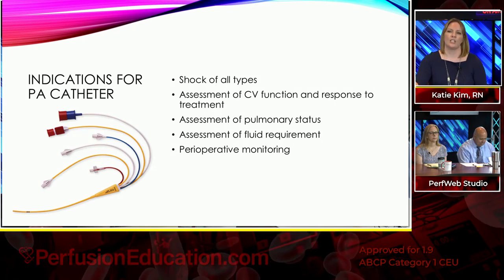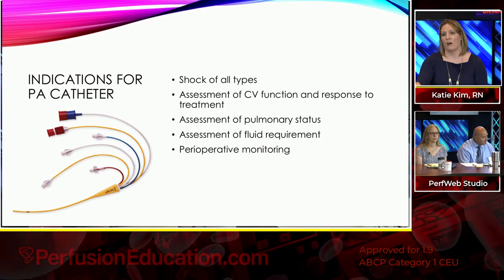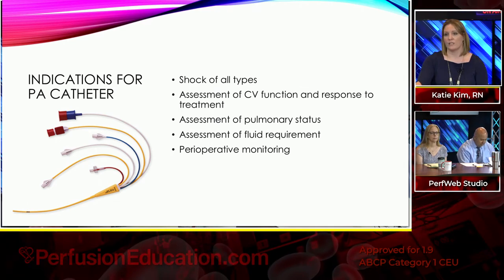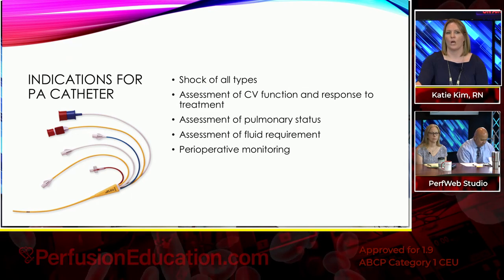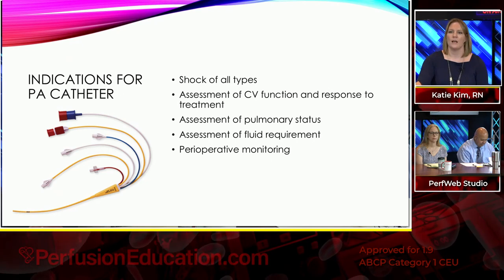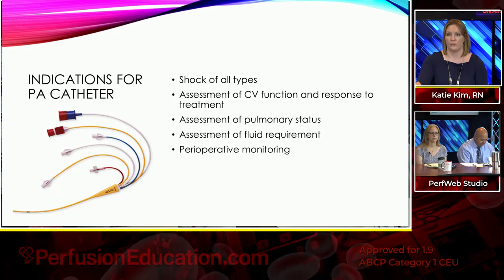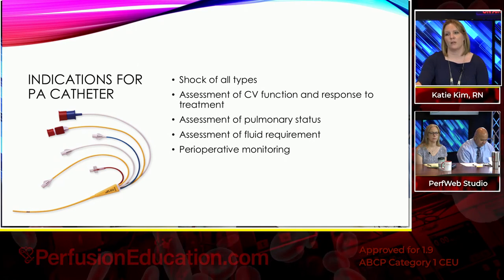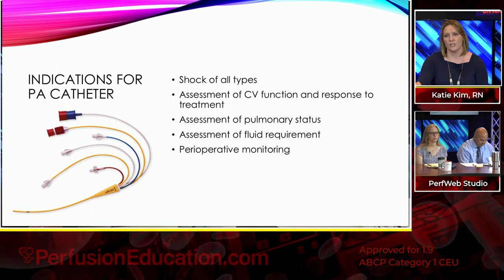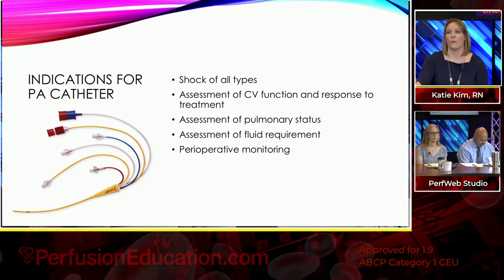So what are the indications for a pulmonary artery catheter? There's shock of all types, assessment of the cardiovascular function and response to the treatment. So you're giving medications, are they working? You're giving fluid, are they working? Assessment of pulmonary status, assessment of your fluid requirement, and then perioperative monitoring. You'll see this a lot, especially in cardiovascular surgeries where pressure differences are really important on both sides of the heart.